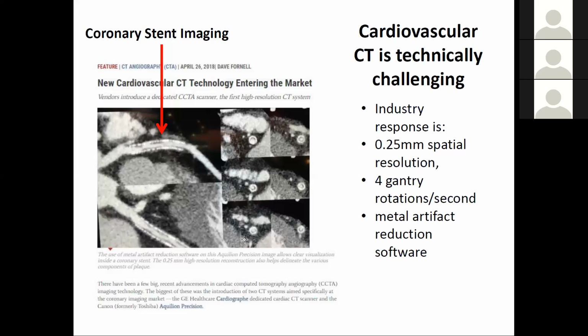any filter back projection stuff around is going to want to streak, because you've got a ramp filter, right? So any imperfections, you amplify the high frequency part of it, and it all goes along that particular line of response. That's where your mismatch is. All those things are based on the fact that you lied to filter back projection by telling it you had infinite statistics and perfect data, which you didn't.